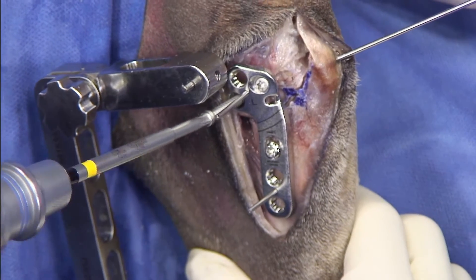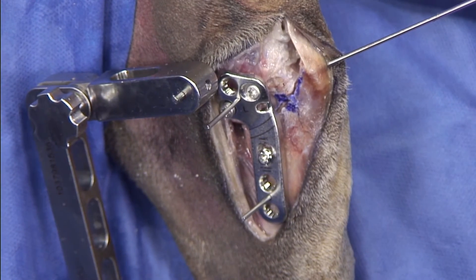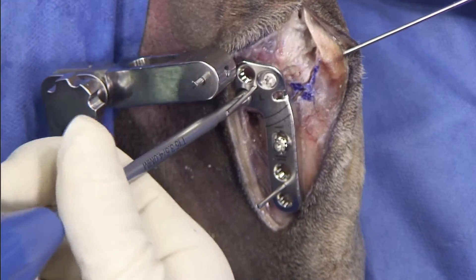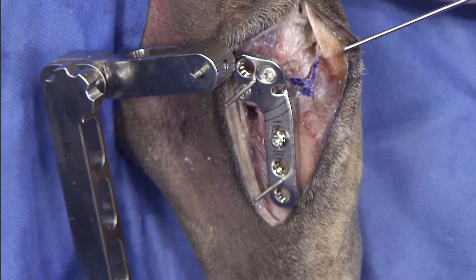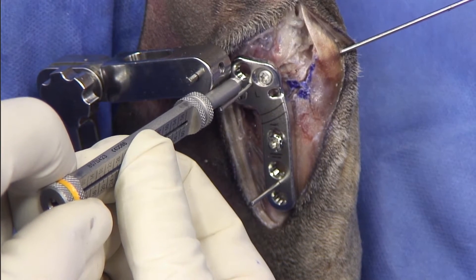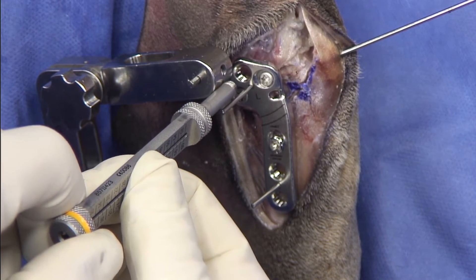In the proximal locking screws you don't always have to add 2 mm. Especially in the most caudal screws, I may not want them too prominent — especially the proximal one — so I would not add 2 mm. At this point we have 2 good proximal screws. As you can see, in a relatively small fragment it may be difficult to place the most proximal one because of the jig.